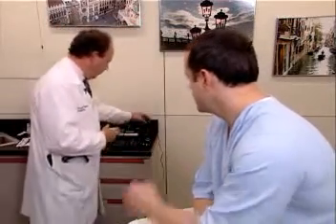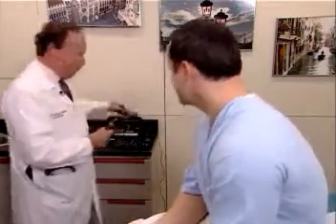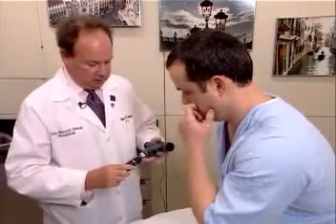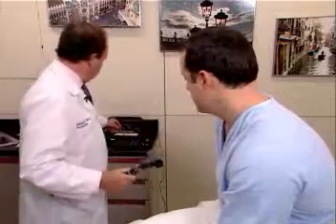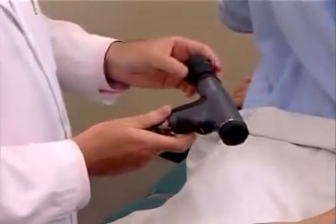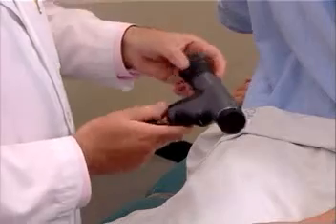The other advantage to the Panoptic is that there is a greater working distance between the patient and the examiner, and I'd like to demonstrate it right now. The Panoptic ophthalmoscope works with any of the standard 3.5 volt handles. This is the head, and this is the eye cup, and I will demonstrate its use in just a moment.